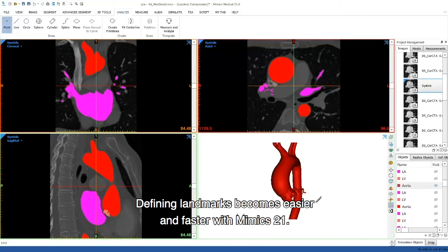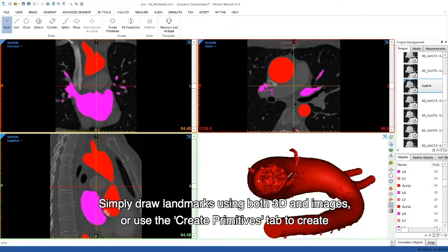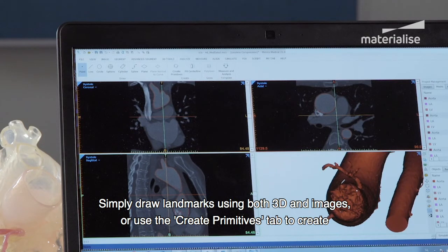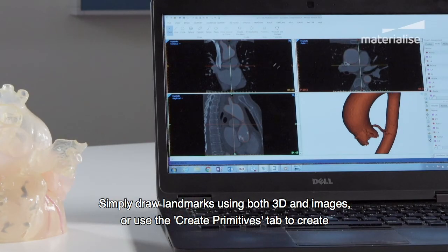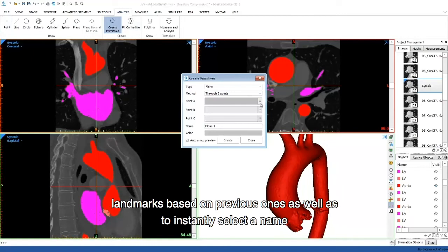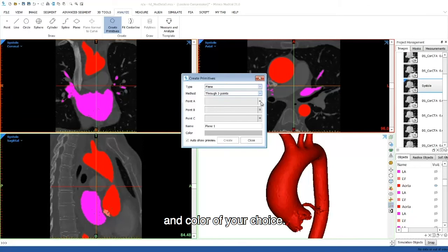Defining landmarks becomes easier and faster with Mimics 21. Simply draw landmarks using both 3D and images, or use the Create Primitives tab to create landmarks based on previous ones as well as to instantly select the name and color of your choice.